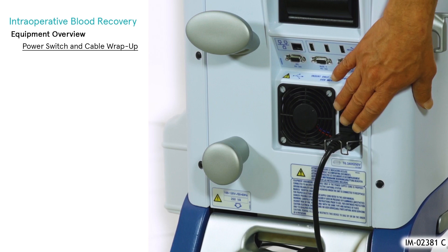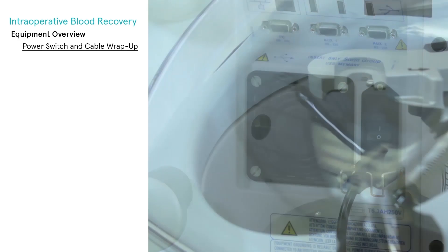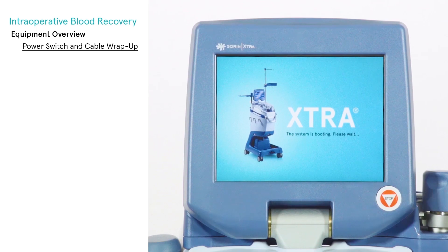To power on the Extra system, push the on-off switch located on the rear panel of the machine, directly above the power cord. During power-up, the cooling fan starts, the centrifuge light illuminates, and the Extra machine is displayed on the touch screen while the system software loads.